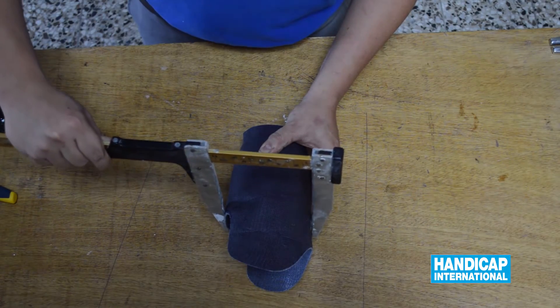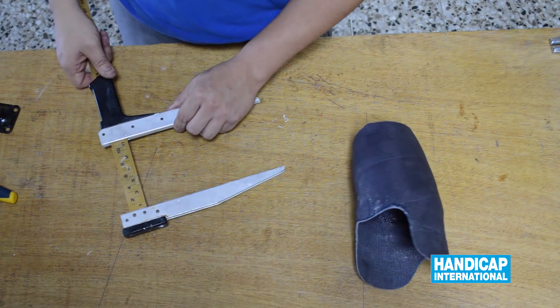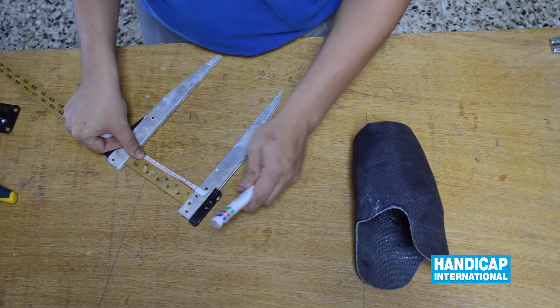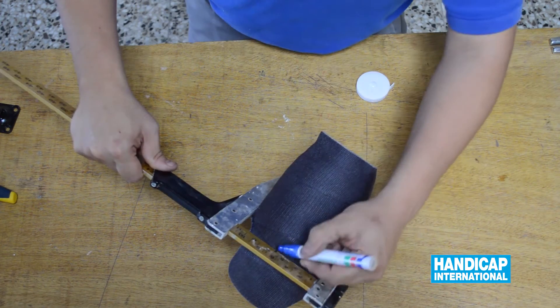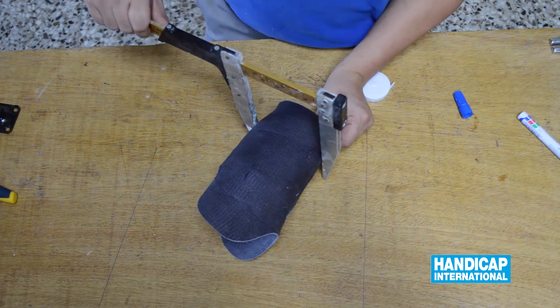Initiate by marking the frontal plane of the socket, splitting it into two equal parts. Continue by marking the sagittal plane of the socket, splitting it into two equal parts.